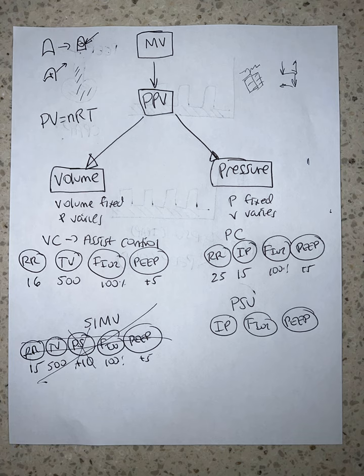You can accomplish the same things therapeutically without having to intubate them and put them on invasive mechanical ventilation, with all the complications and the barotrauma and the difficulty with swallowing, and the risk of infection, and all those things that come with invasive mechanical ventilation are bad. So if we can do it with non-invasive mechanical ventilation, as long as they're an appropriate candidate, they have to be awake enough to protect their airway, or to maintain an open airway, and not have craniofacial abnormalities.